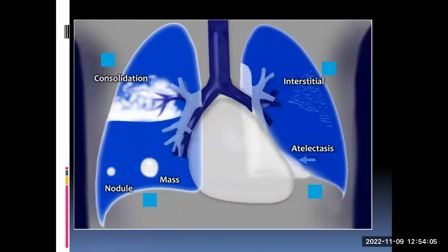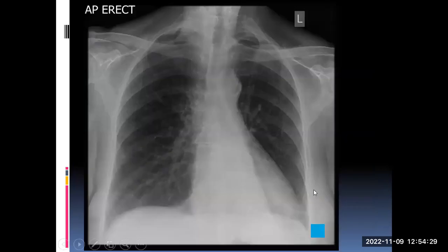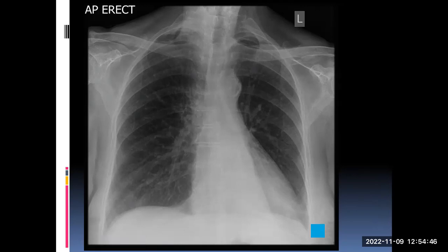Finally, I am going to talk about atelectasis, which is synonymous with collapse — we always write atelectasis because it sounds nicer. Different parts of the lung can collapse, either a total lung collapse or lobar collapse because different bronchial connections sometimes cause separate collapse. Consolidation does not change the volume of the affected lung. But atelectasis is when there is no air within the alveoli — they just collapse — so there is no air bronchogram and the volume is reduced.